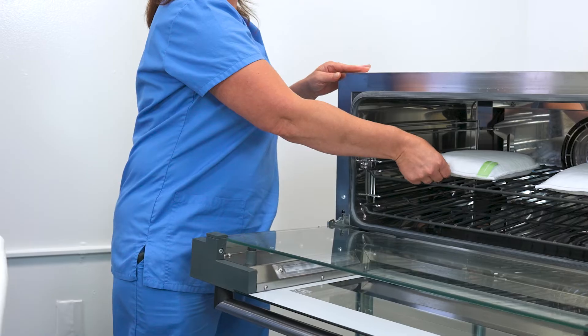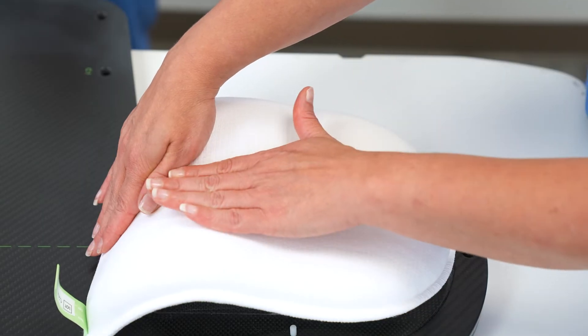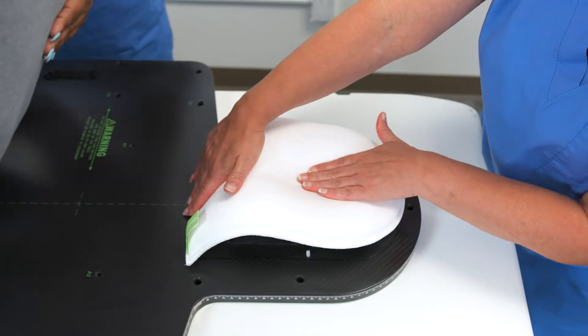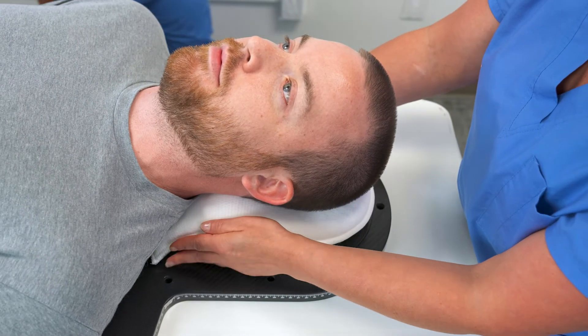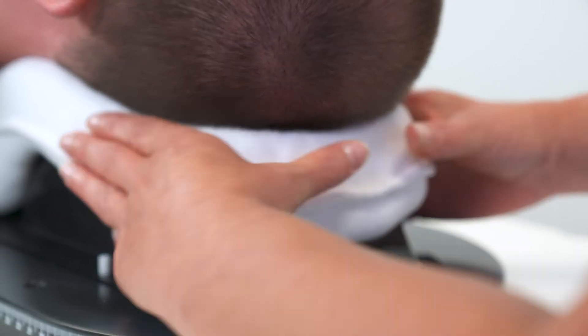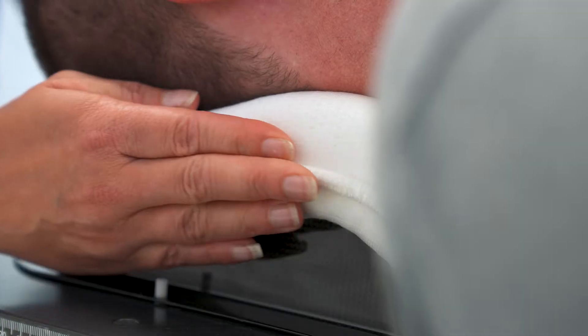Once your cushion is ready, place it directly on the headrest or overlay and have your patient lie down. From here, you can sculpt the cushion around your patient as needed, including adjusting for pitch or tilt. Make sure there's clearance for the mask, and gently smooth the cushion around your patient's head and neck with a flat hand.